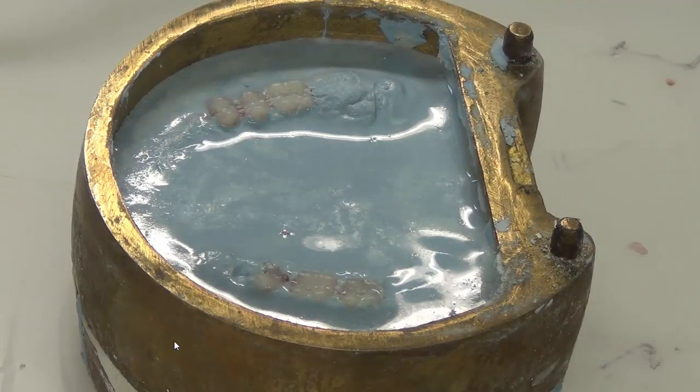It also has another function. While we are deflasking, meaning I want to harvest the completed denture, when I'm doing the deflasking step, it can also resist the hammering, because I will take out the denture once it's solid by hammering it out. So it will also resist the hammering procedure, not transmitting it to the denture and teeth.